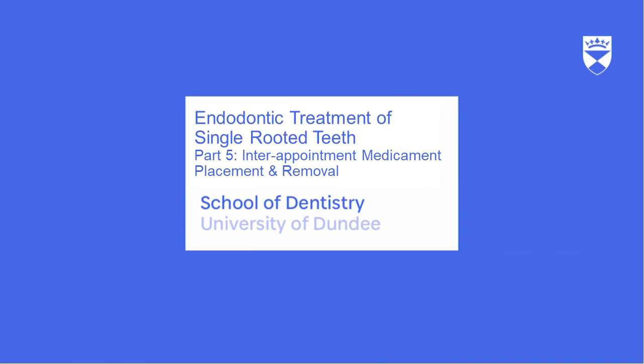This video is the fifth part of a series which will explain the basic principles of root canal treatment of a single rooted tooth with simple root morphology. In this video we will discuss the steps taken in the placement and removal of inter-appointment medicament.